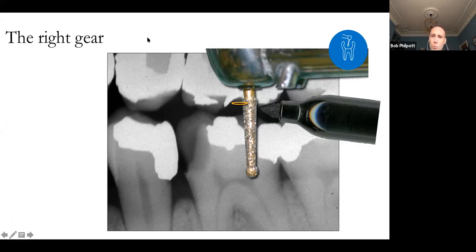Someone has asked as well, would I use a round-ended burr like this? I don't actually. I've just stolen the image because Dentsply kindly provided it to me. I use a flat end on mine. I historically liked what was called a 630 burr, but I have found that that's too wide, and this will highlight my ignorance about the variety of burr systems that are there.